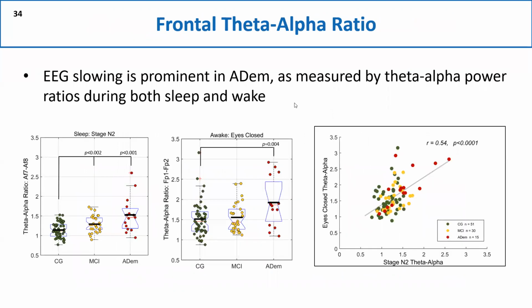Another area of our research is combining the sleep biomarkers with biomarkers that our company is developing for waking state EEG. In fact, all of our National Institute of Aging grants were based on the premise that we can do better at differentiating somebody who's likely to have Alzheimer's disease from Lewy body dementia if we can combine what the EEG looks like during waking state versus what's going on during sleep.